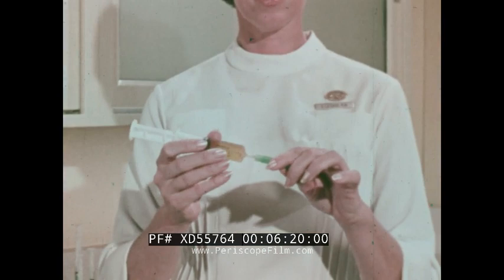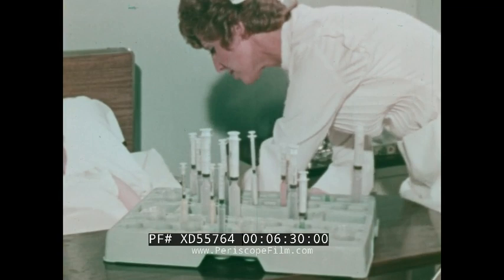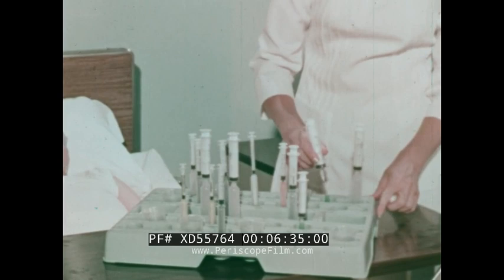After medication is drawn, the unit is resheathed. For delivery to the patient, the unit is placed in one of the wells of the universal monotray in a vertical position. After the injection has been given, the contaminated unit is safely returned to the needle sheath with a simple one-hand motion.